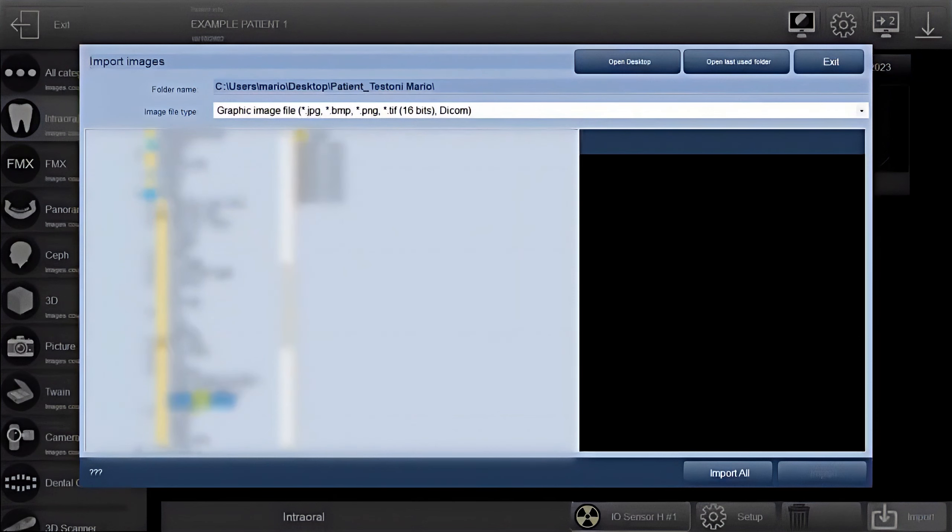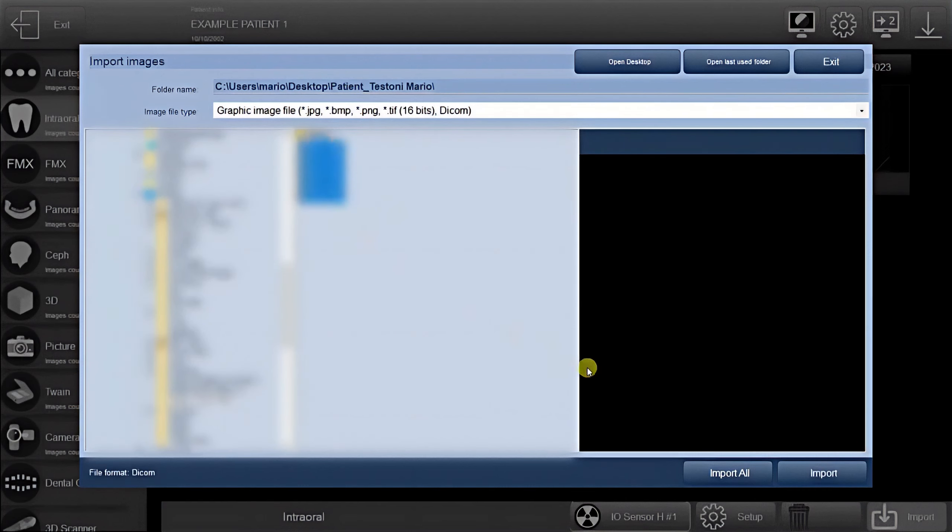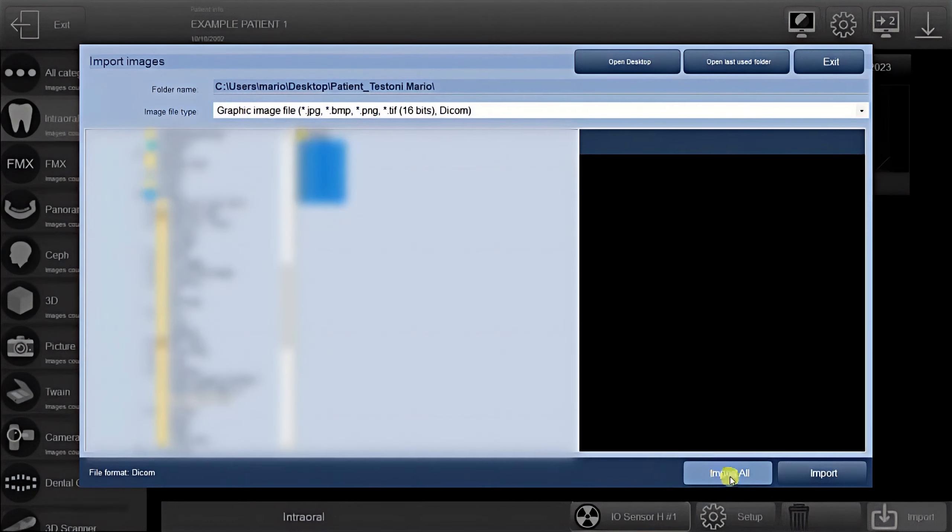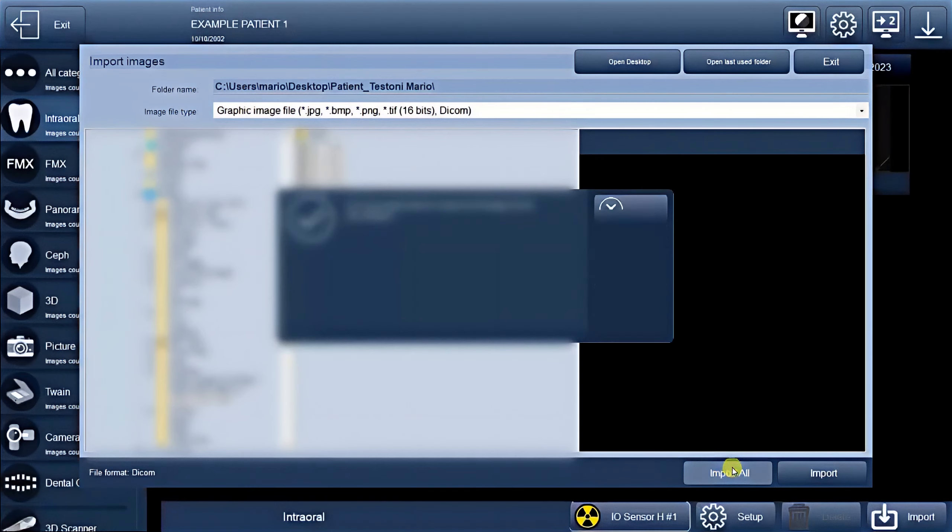From there, simply locate and select the images you want to import. Once you've found the desired images, you have the option to import a single image or choose to import all the images within the selected folders.